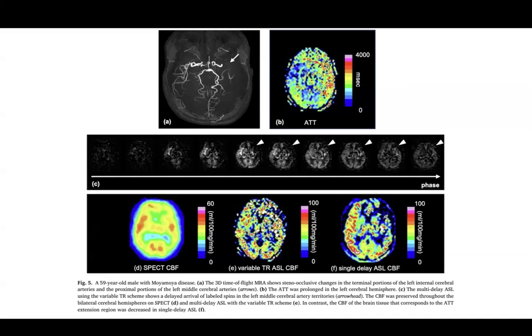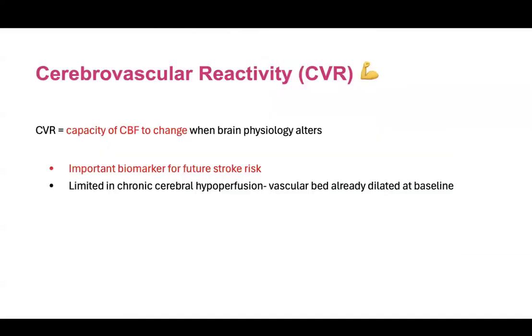Perfusion as a parameter is very difficult to reproduce. With the same software it may be replicated, but with a different scanner the software is different. So all the trials have told that perfusion has to be optimized within the institution. That means you have to develop your own protocols.